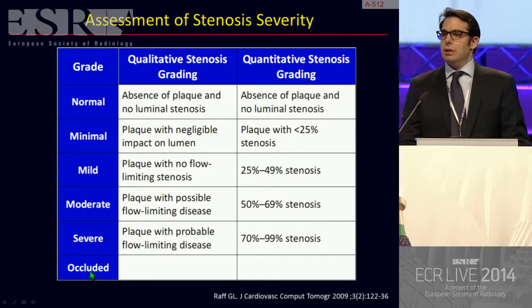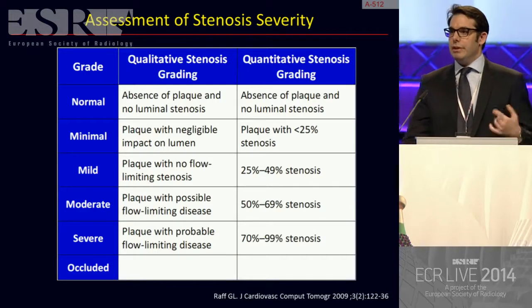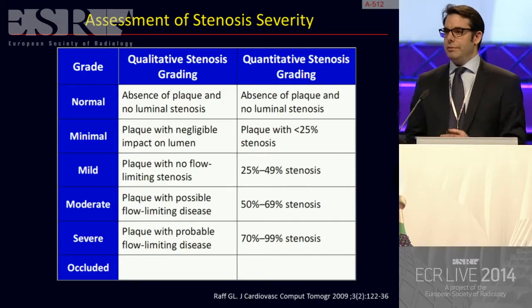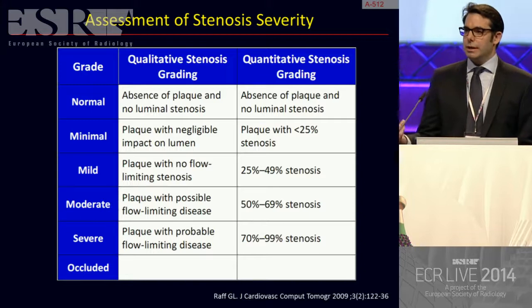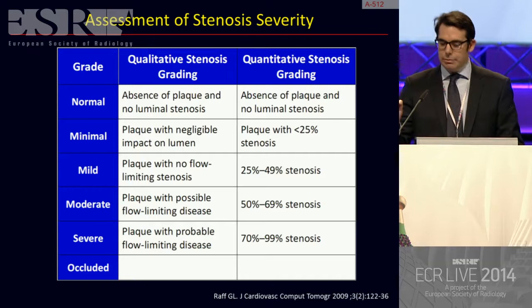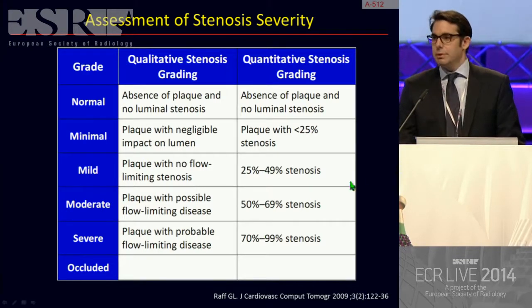This is usually not very much liked by cardiologists. They will prefer numbers. For us, anatomically, more than 50% is what we would consider significant stenosis. We should say more than 50% or less than 50% luminal narrowing. But cardiologists sometimes want a little bit more. If they do, go 50 to 69% stenosis, more than 70% stenosis. Always percentages because of the limitations of the spatial resolution.